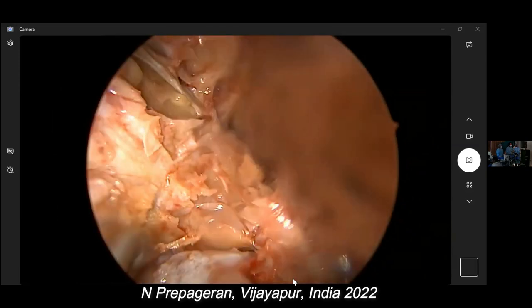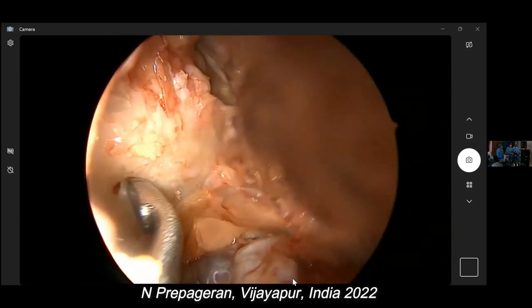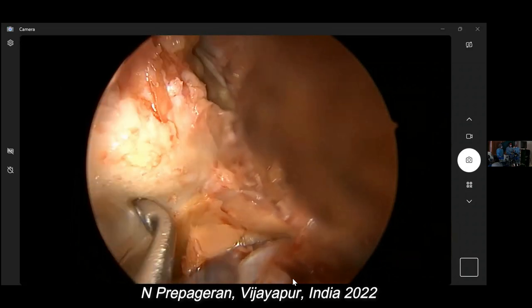So let me remove the bone down there. Yes, the floor is open. This is your inferior rectus. Clear.